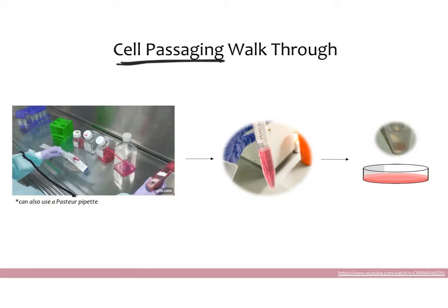She's going to use this pipette to take out the media in her flask, wash it with PBS, and then put the trypsin on. This is your PBS and this is your trypsin. She puts the PBS on, then the trypsin, and lets the cells detach. After that, she spins down the cells, and you can see she got a nice pellet of white cells at the bottom. Now she can remove all the media and trypsin, leaving just a little bit at the bottom to protect the pellet.